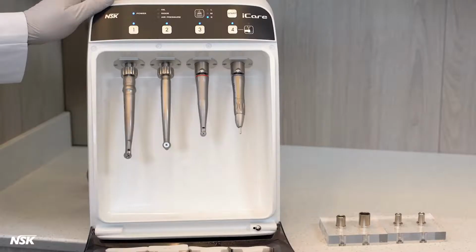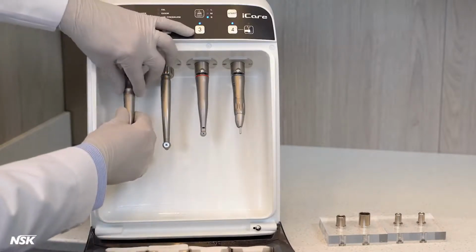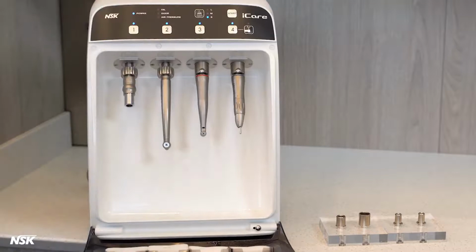Unscrew the direct connect air-driven handpiece and use both hands to pull back the PTL adapter sleeve and pull out the high-speed coupler type handpiece.